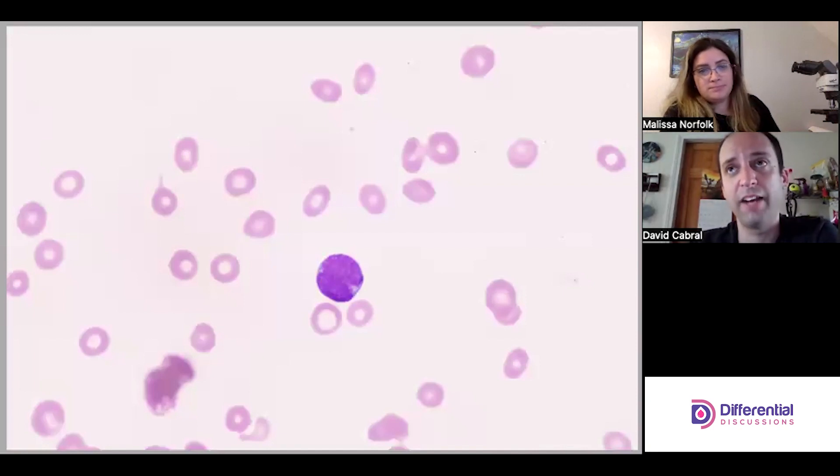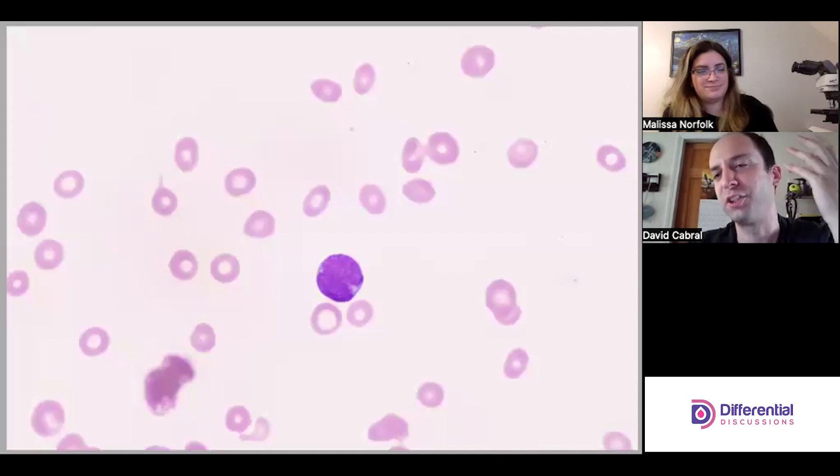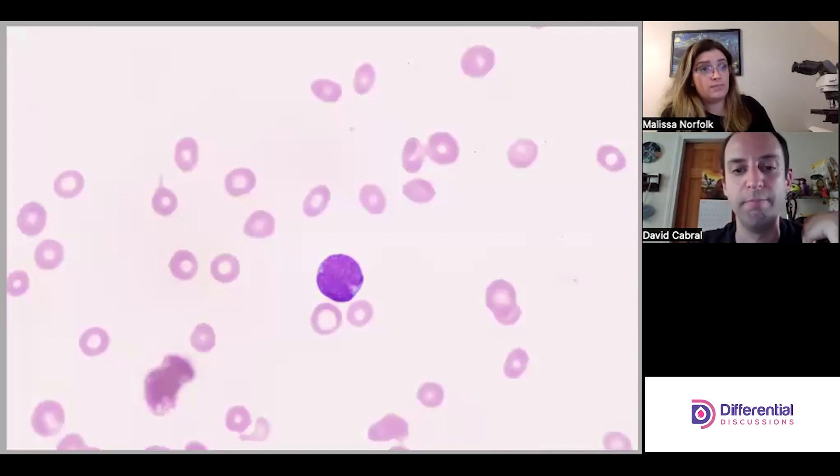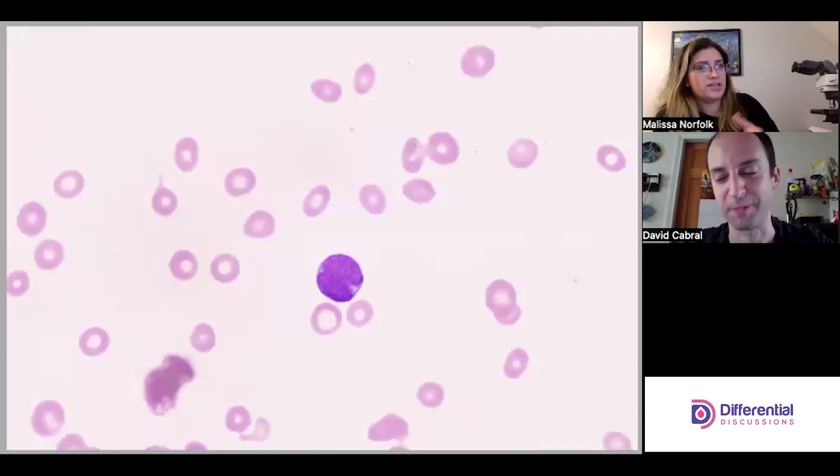I've leaned on the other presentation markers a lot. This particular patient, there's no platelets, the patient is incredibly anemic. When you have extreme situations like that, it becomes a signal that you might be dealing with some kind of leukemia. We're not in a bad area here, there just is no good area. They're so anemic that it's hard to find a good spot. When you're making the smear, my guess is it went long and there's not a lot of cells.